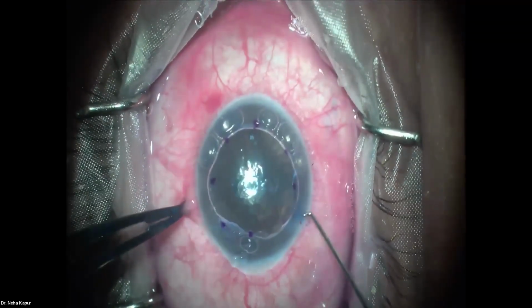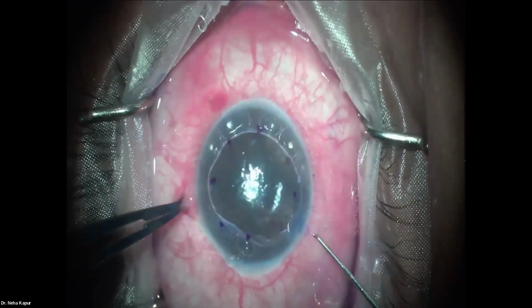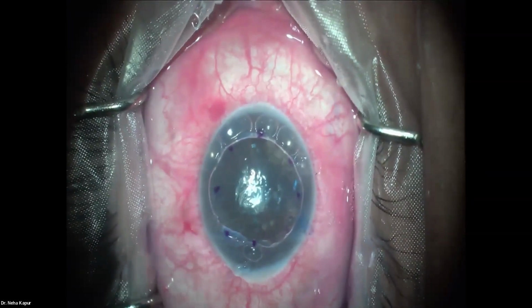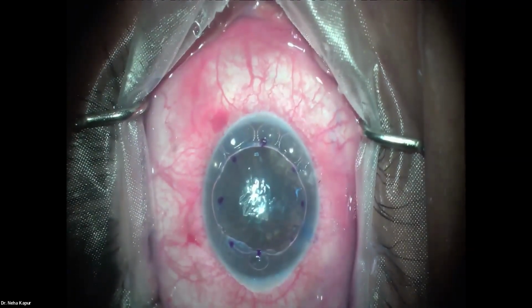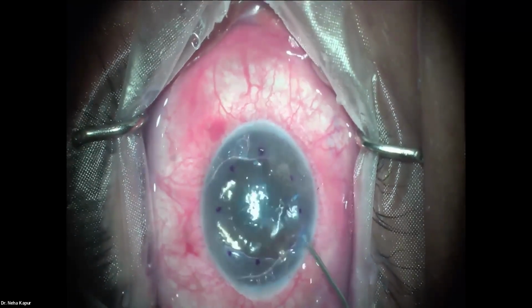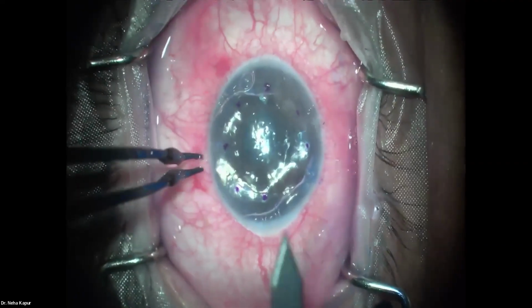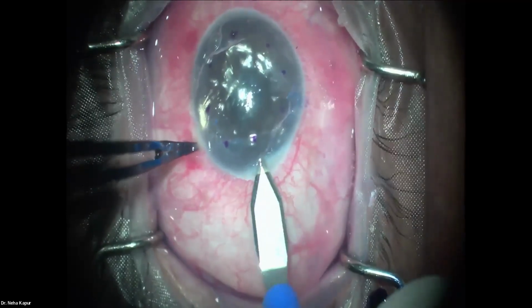The tissue is clear of Descemet's now. Keratome. So once this is ready, we make a keratome entry and get our Sheets glide into place. So we like to make a clear corneal entry.